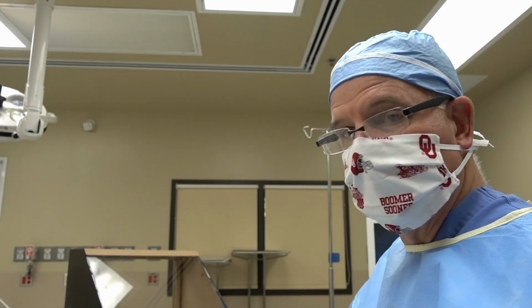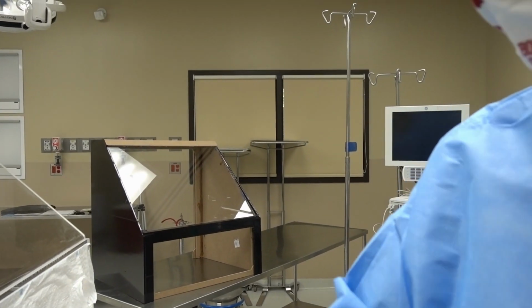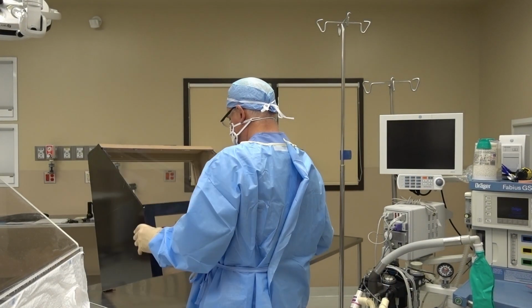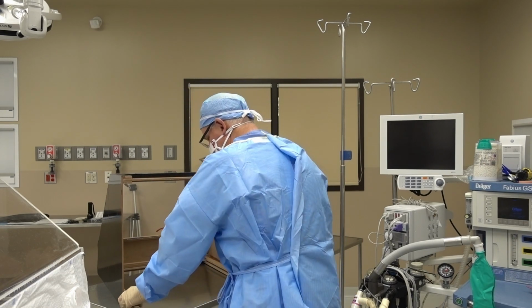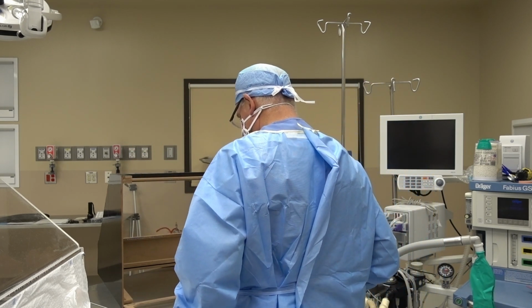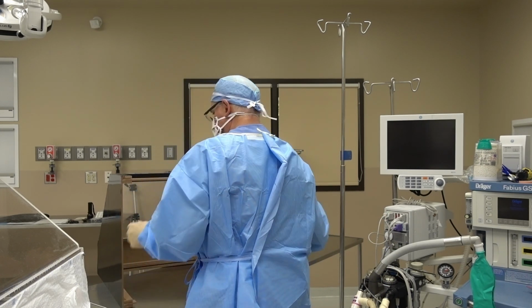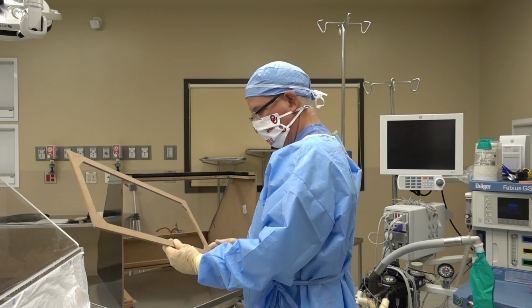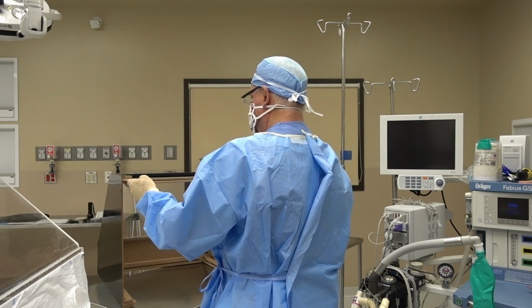And this system is simpler to manufacture, or especially if you're making it yourself. A plastic shop can do this. This one I used 2 half-inch rail systems. Quite simple. You just slide it in, put your bag on, the big bag, slide it back in, and it will seal. And then the top one is again just like that other one. You can see where this has been made, handmade. And again, put it in, slide it in, and you're ready to go.